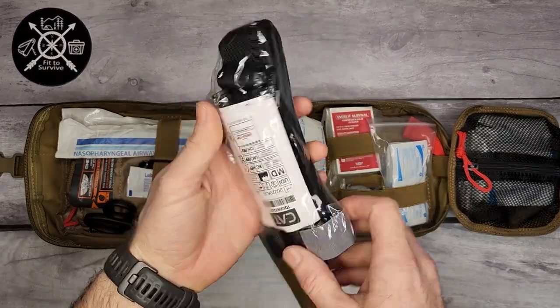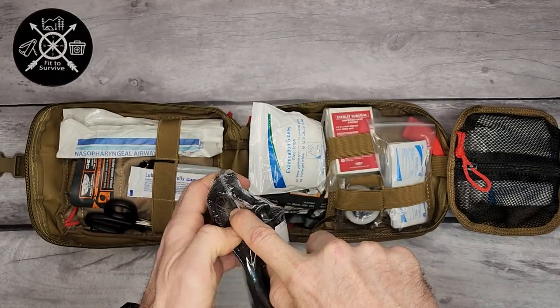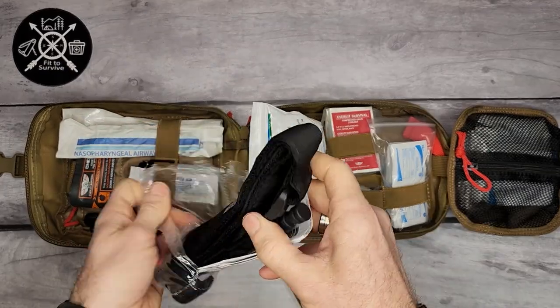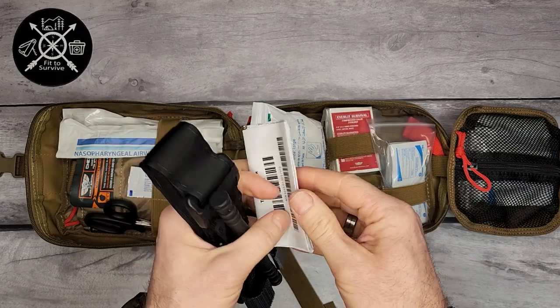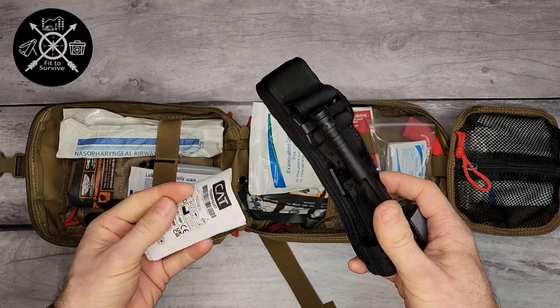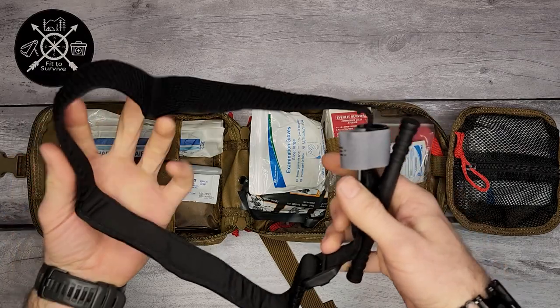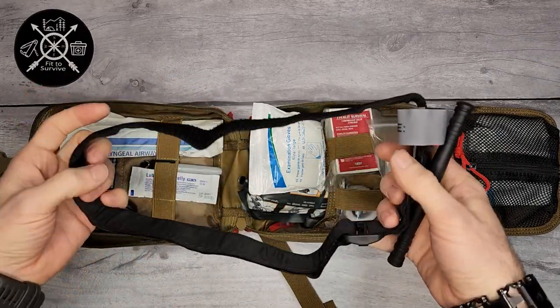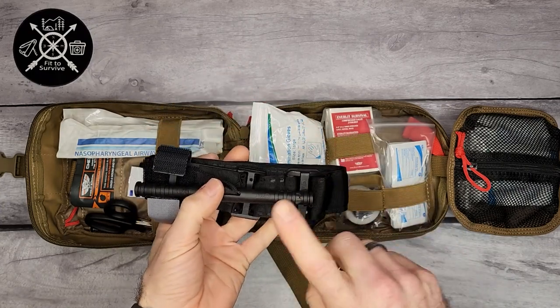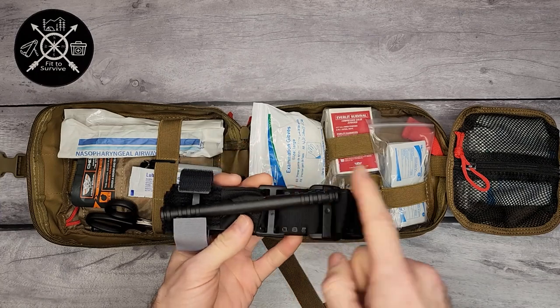Right up top we have a tourniquet — your standard, really simple tourniquet. It has some instructions on how to use it, but you definitely want to know how to use it before you need to use it. I like the intelligent way they have it folded. If you don't know how to use a tourniquet, I definitely recommend getting some experience with it beforehand.